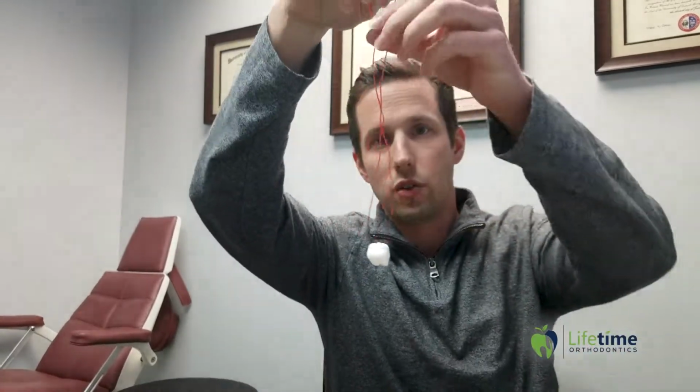And then the final thing we have, probably the funnest thing, are these little tooth holders. We have missing teeth every single day, and we want to save them for the tooth fairy. So you can place those teeth right inside of here, wear it proudly for the rest of the day around your neck, and take it home, put it underneath your pillow, and there you are. So there you have it.